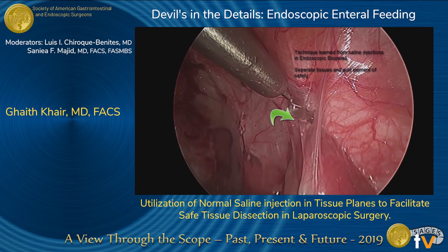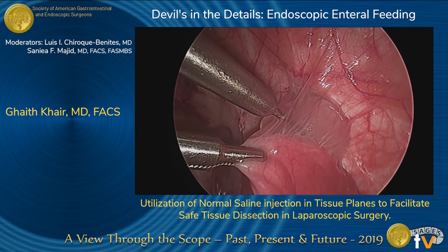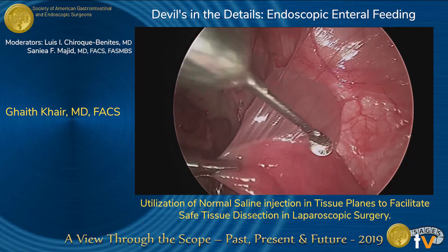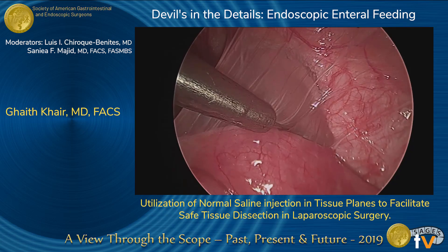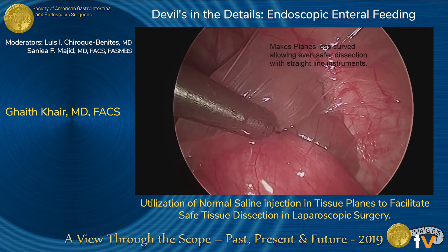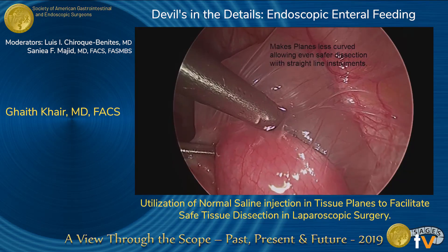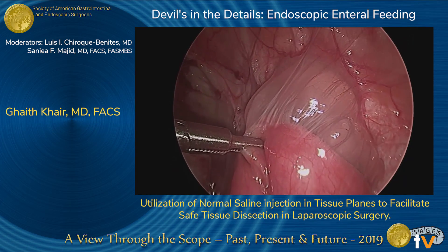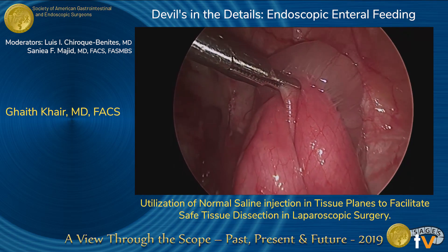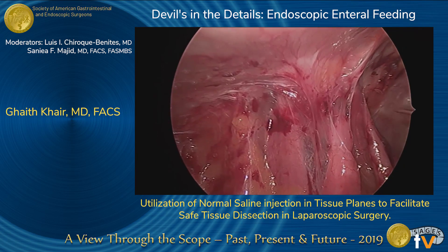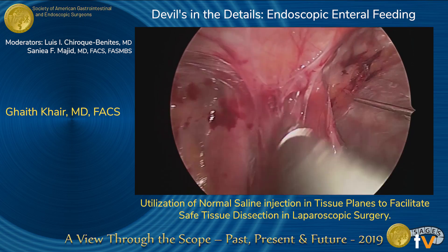We describe a technique where we use a gallbladder aspiration needle and find a plane between the abdominal wall and the small intestine, and inject this area with normal saline. This allows the intestine to be displaced in a downward direction, allowing a straight-line instrument to divide in the direction of the instrument.